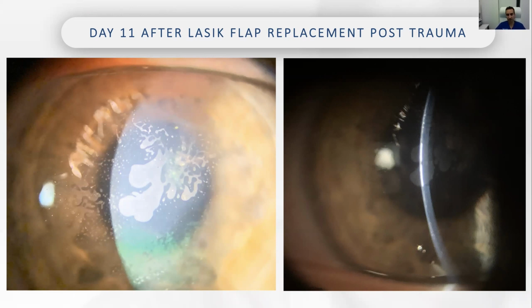The patient did very well. On day 11, she came back telling me that her vision was worse, and that's what we see: epithelial ingrowth smack in the center of vision. And of course, this slit lamp can tell us much. It looks like this epithelial ingrowth is in the interface. And of course, as a knee-jerk reflex, one would just take it to the operating room, lift the flap, irrigate, put suture, and maybe even glue sometimes, and follow up the patient. But again, I couldn't really get the depth of the epithelium, and I felt not really sure.